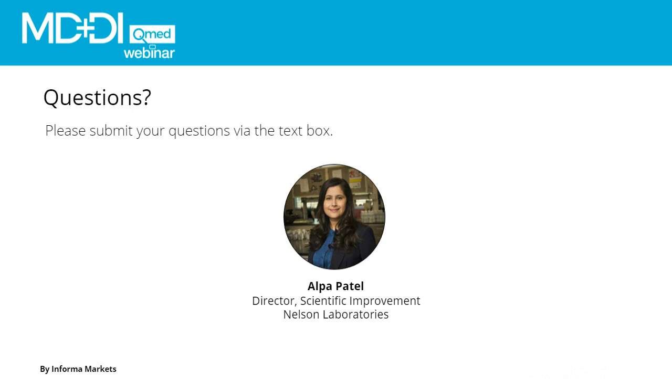Sure, that makes sense. Okay. Here's a question about discarding. We talked about this a little bit. When does one discard a reusable medical device? And are there any criteria you can use to make this decision? The only way you can make this decision is by testing. We can't tell you when your device can be discarded. A manufacturer has to know at what point the device stops functioning.